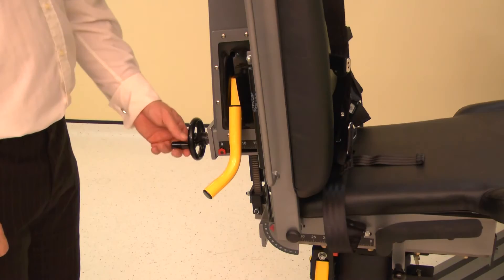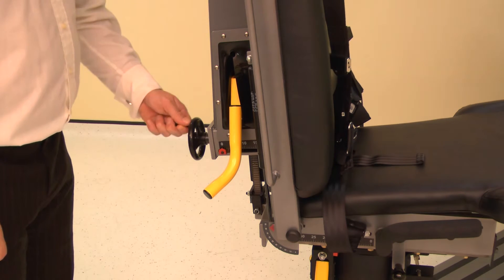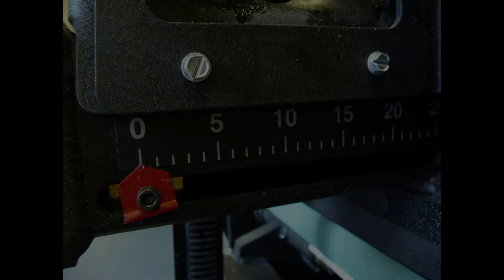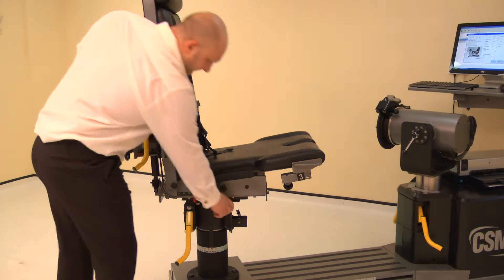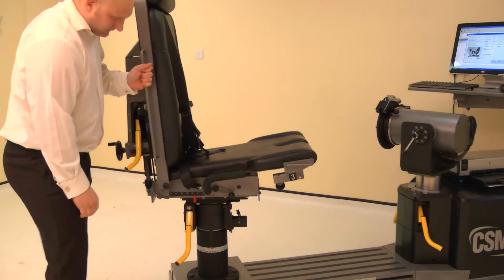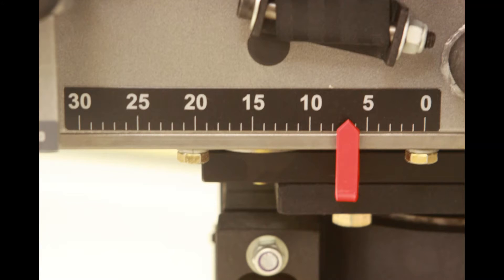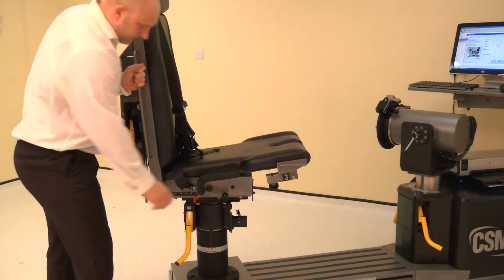Set the chair back translation by winding the handle; adjust the chair back translation to position 0. The chair fore-aft is altered by raising either locking handle, then sliding the chair bottom forwards or backwards. Adjust the chair fore-aft to position 7, then lower the locking handle to secure.